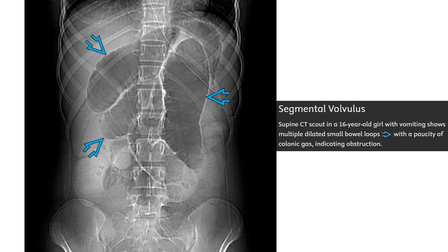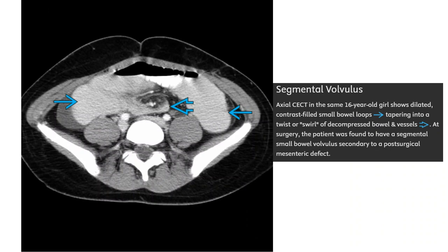CT scout view in a 16-year-old boy with vomiting shows multiple dilated small bowel loops with paucity of colonic gas, indicating obstruction. Contrast-enhanced CT in the same patient shows a dilated contrast-filled small bowel loop tapering into a twisted whirl of decompressed bowel and vessels.